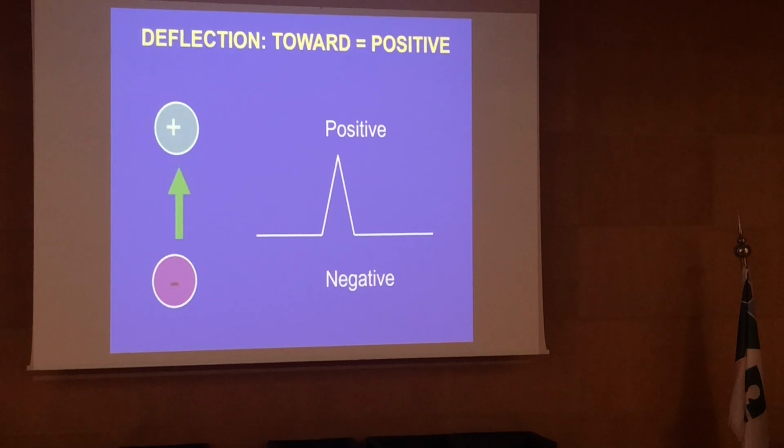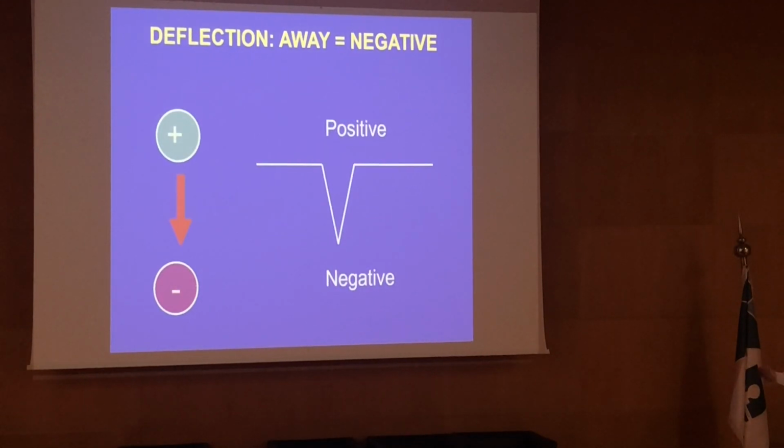Second important thing: I showed you the electrode we placed on the chest. There are positive and there are negative electrodes. Always we concentrate on the positive electrode. So if the activity of depolarization, or the wave of depolarization, is moving towards the positive electrode, it will produce a positive deflection, so it is above the line. If it is moving away from the positive electrode, it will produce a negative deflection.